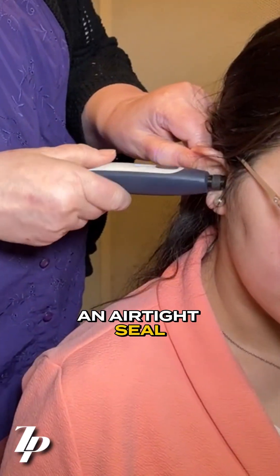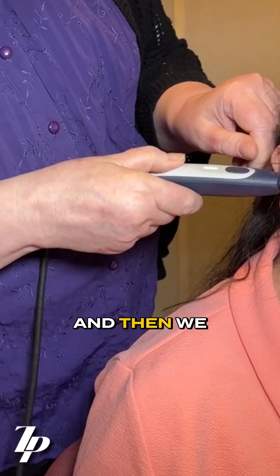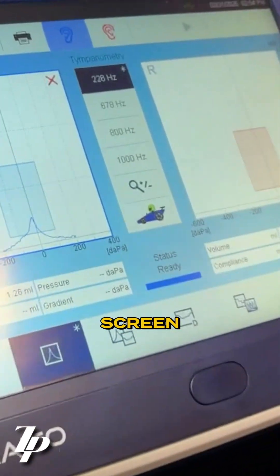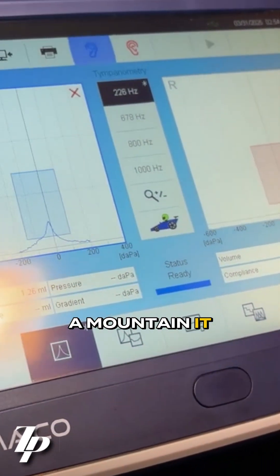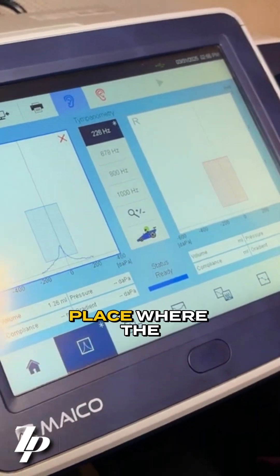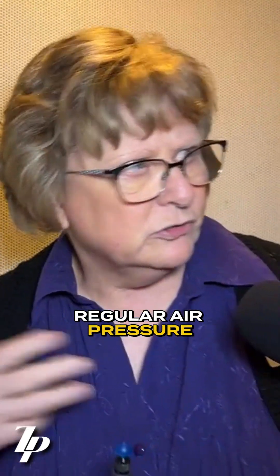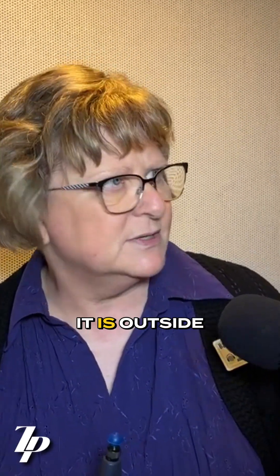And it makes an airtight seal. Then we get a beautiful curve on the screen — it looks like a mountain. It tells us that the place where the eardrum is moving the most is right at regular air pressure, just the outside air pressure — zero. So it's the same inside as it is outside.